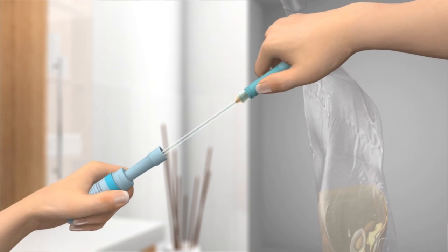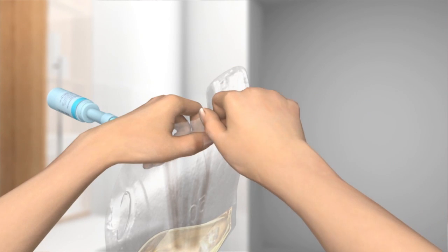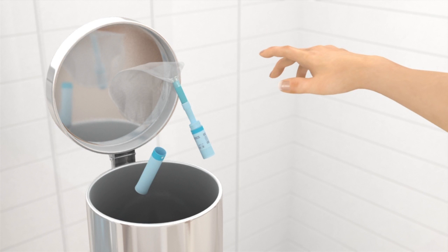Put the catheter back into the tube and reseal it by twisting the catheter clockwise. Open the urine bag by tearing off the tab and empty it into the toilet. Twist the bag around the tubing and replace the lid. You can dispose of the catheter set in your household trash. Do not flush it down the toilet.